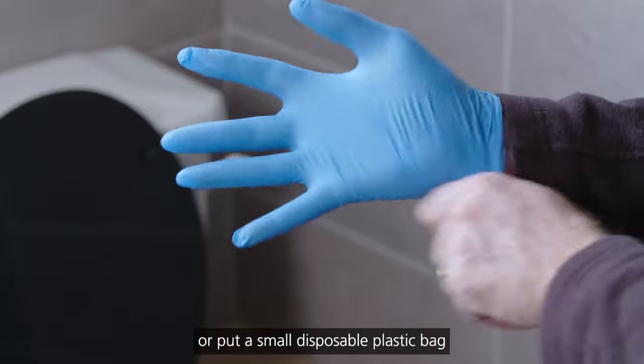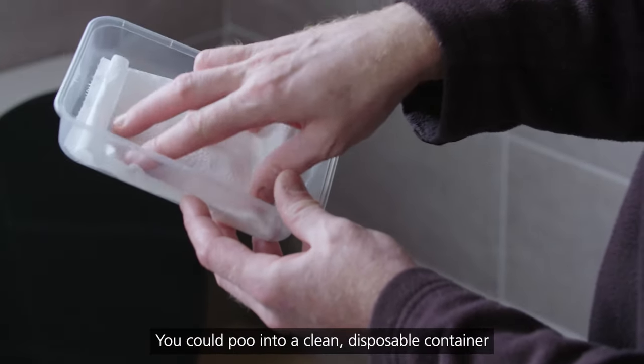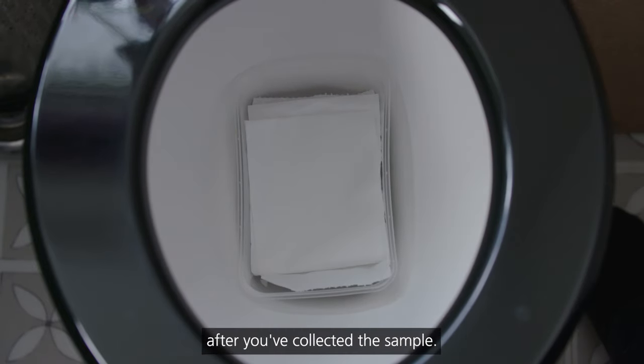Put a small disposable plastic bag or glove over your hand. Or you could poo into a clean disposable container lined with a sheet of toilet paper, so that you can easily slip the poo into the toilet after you've collected the sample.